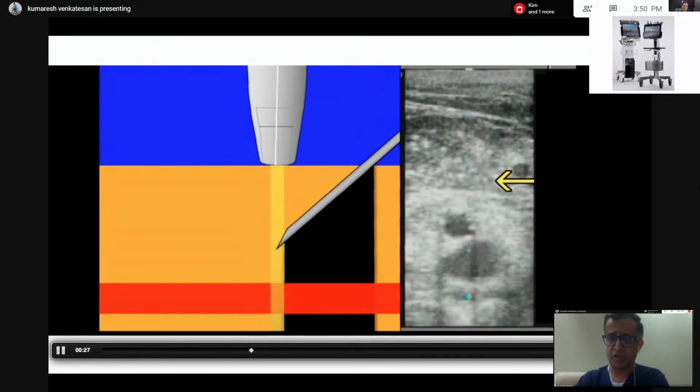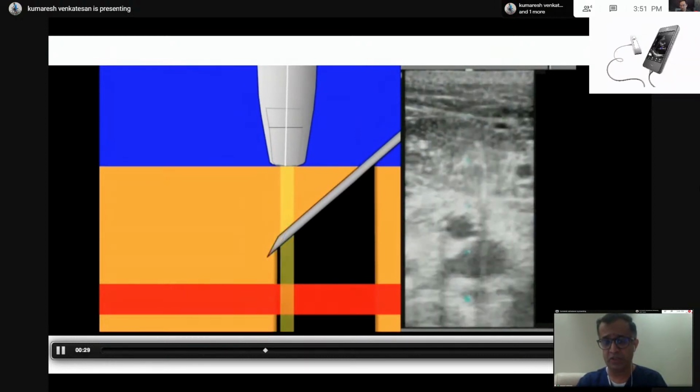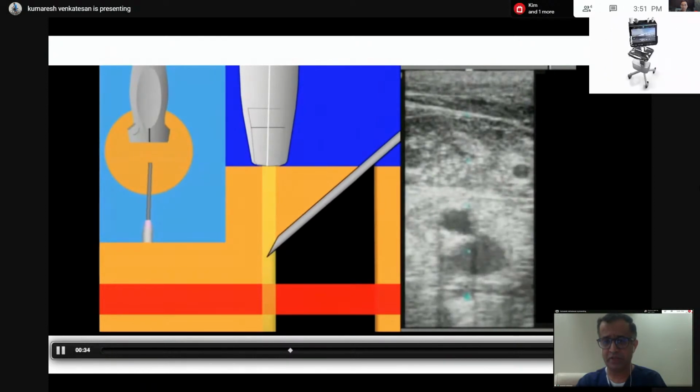Compared to cannulation of the internal jugular vein, the femoral vein can often be challenging, partly because there is a lot of fat overlying the groin area, and that makes the visualization of the shaft and the tip difficult. So you constantly move the probe back and forth to see where the tip of the needle is.